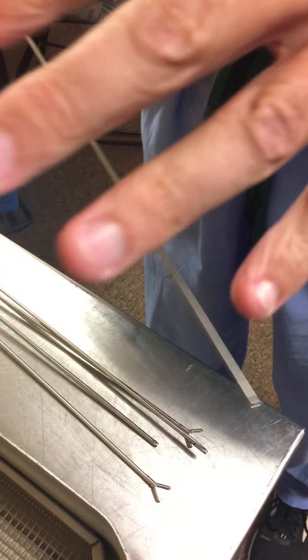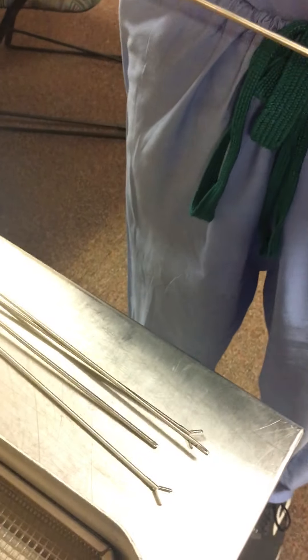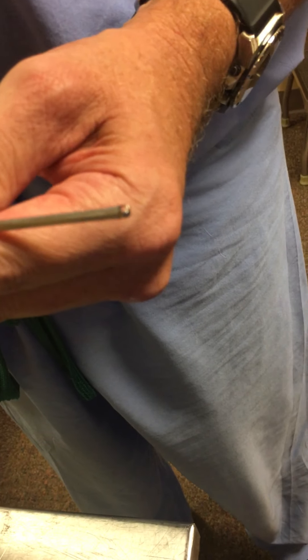We also have hand instruments used through the nephroscope — they don't go through the ShockPulse itself. The ShockPulse goes through the nephroscope to treat the stone. If the physician wants to grab fragments, the three-prong grasper is pretty common. There are various other graspers available, and the physician will let you know what they need.